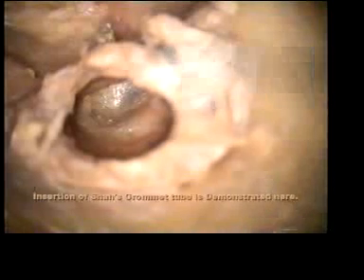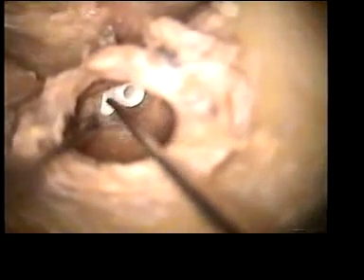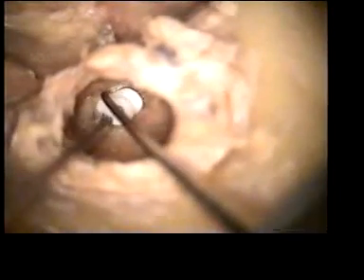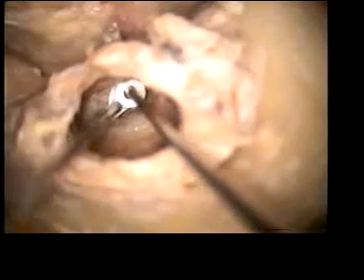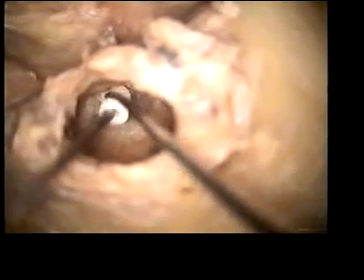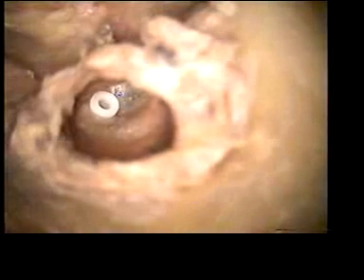Any fluid in the middle ear is sucked out carefully. Next, a grommet tube is inserted. In this exercise, insertion of a Shaw's grommet tube is being demonstrated. The grommet tube is dropped onto the tympanic membrane using a crocodile forceps. Next, the side flange of the Shaw's grommet tube is inserted through the incision first. The remaining part of the grommet is gently pushed using a smooth curved hook. This completes insertion of the grommet.